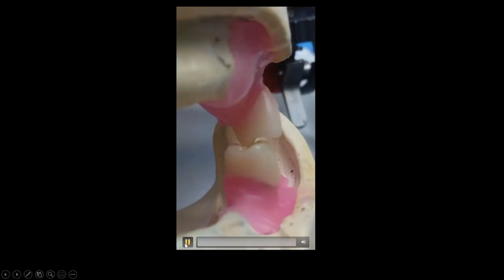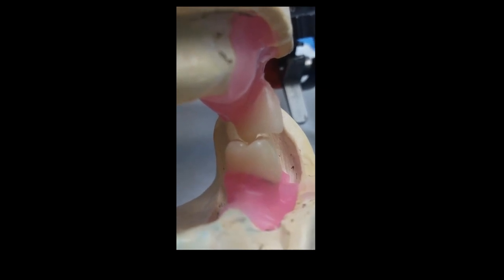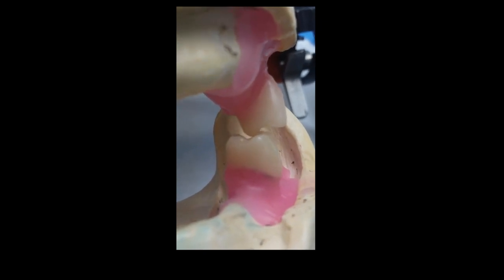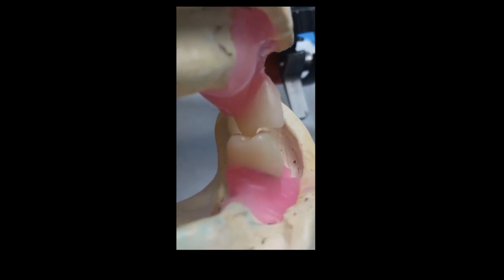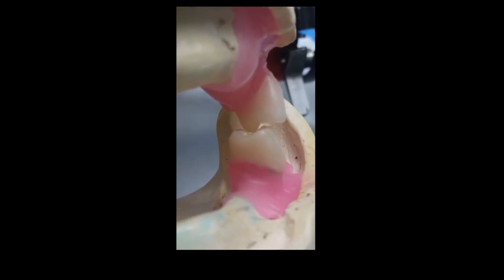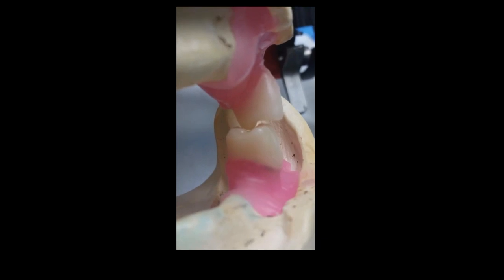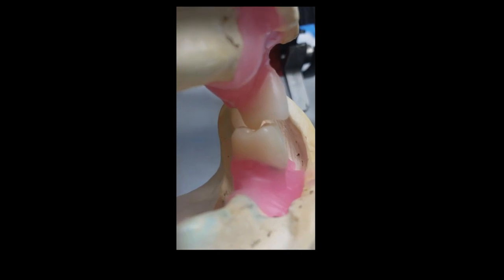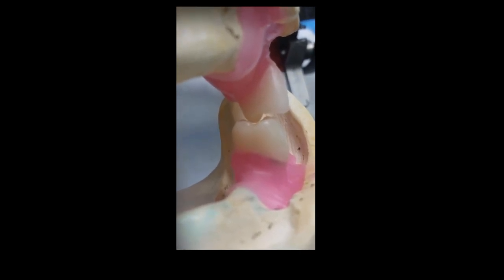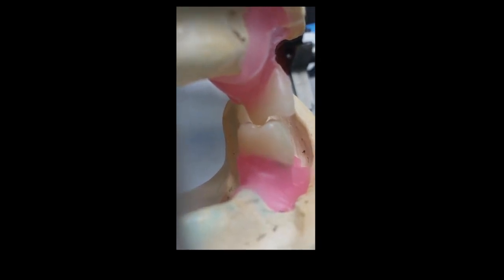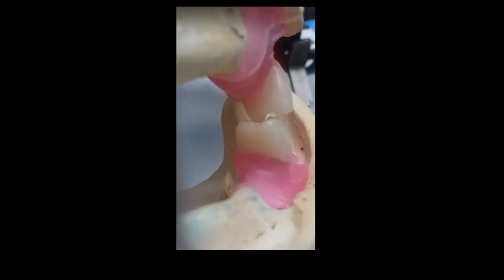This is what freedom in centric looks like on an articulator. I can wiggle it in centric — there's a little bit of freedom. We're going into full working and balancing, but there's that little wiggle room. Whether or not you use an articulator that has it, the teeth from Vita come with it built in. When you go through a chew cycle, instead of a bullseye to land on, you're giving someone a helicopter pad. That creates the stability.